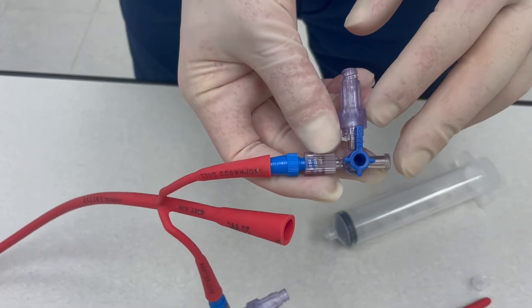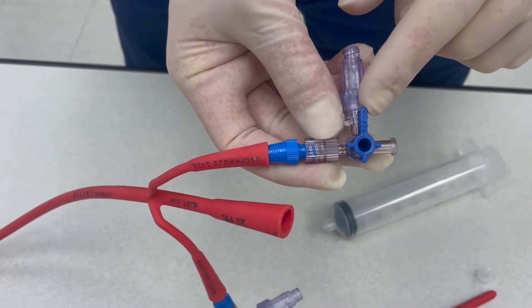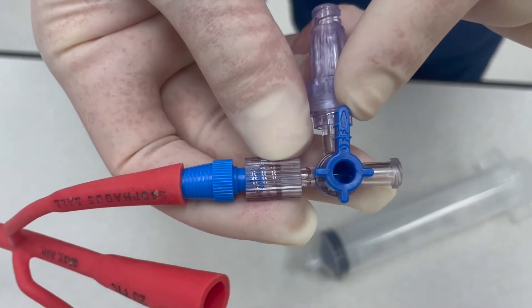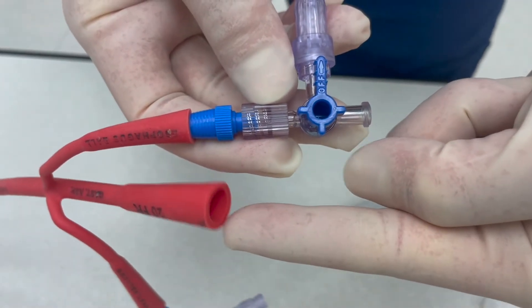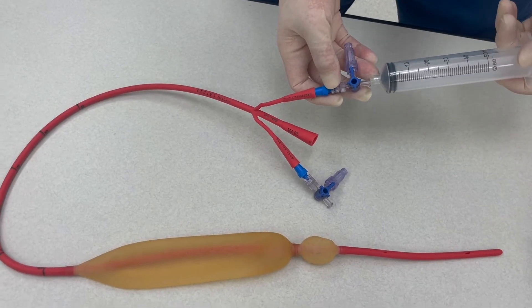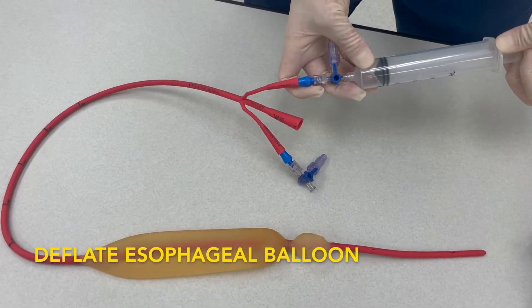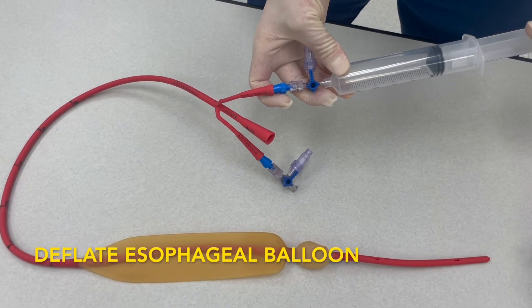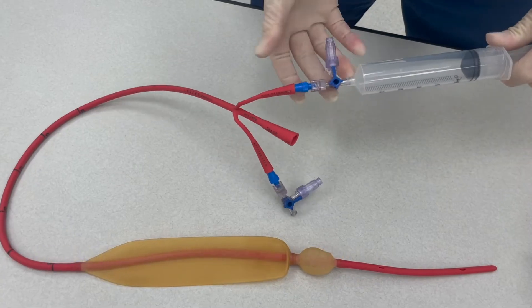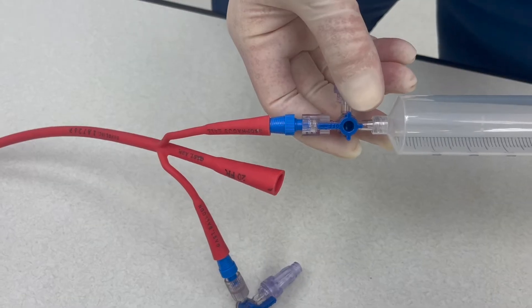Pay special mind to the direction of the three-way stopcock indicator. The arrow will always point in the direction that it is turned off to, meaning air will flow through this direction. Take your 50 cc syringe, insert it into the esophageal balloon, and pull back to deflate the balloon entirely. When you're finished, turn the arrow indicator on the three-way stopcock towards the Blakemore. This will prevent air from leaking.